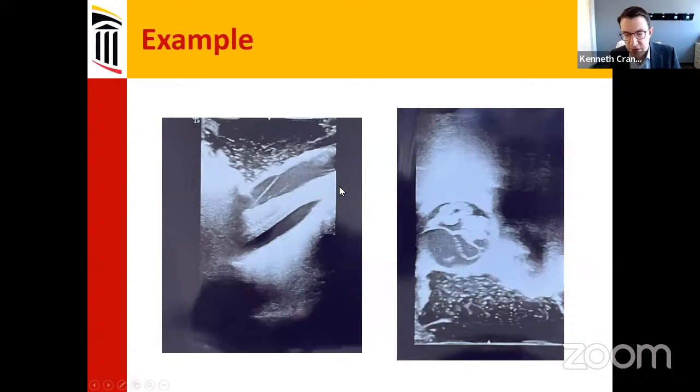And then we looked with the ultrasound. And when we looked with the ultrasound, this left image is a sagittal image right at the conus, which is where that cyst, or we didn't know what it was, that hyperintense fluid signal was pushing on the cord and displacing it ventrally. And you could see here that it was fine. Now that it wasn't there, the conus and the cauda equina were free floating. You can see some areas of arachnoid there, but they're not compressive.